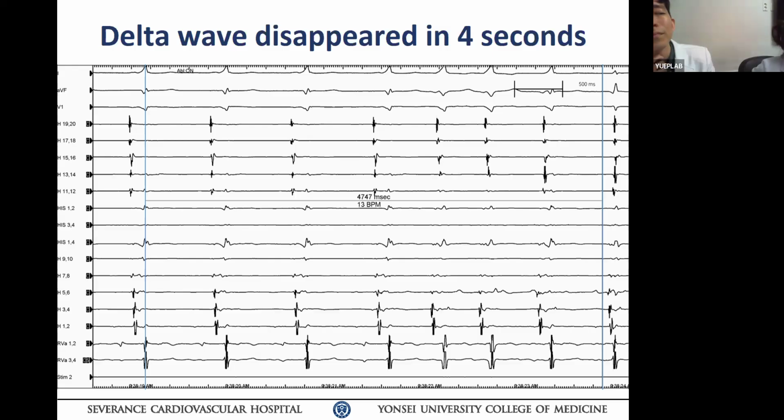You have to have this automatic tissue firing itself near the atrial insertion to have a pre-excitation. You can see your lesion effect in the atrial signal, CS 56. See that? Getting QS now. Then you suddenly have this response. Please find the ablation signal and send it to me by email, and also send your first slide to him, so you can look at it again tonight.